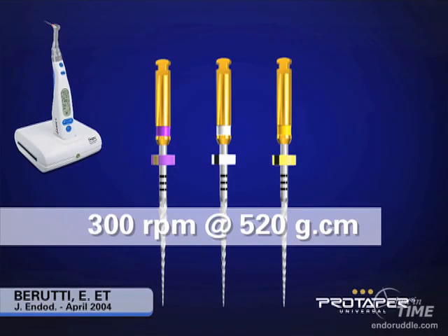An important distinction with ProTaper, as compared to all other file systems again, is we use a high torque. And that's because you need a high torque on any instrument that has changing tapers over a single blade. We use a single speed of about 250 to 300 RPMs. I really won't quibble with you on the speed selection, but we need to be in agreement that it's 520 gram centimeters for all ProTaper files.